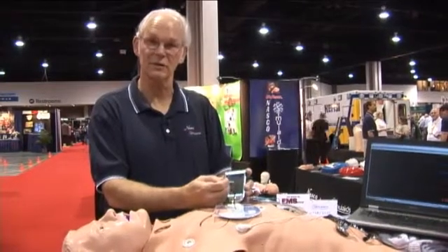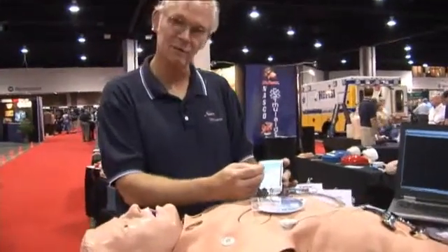It lists for under $20,000. It has a lot of unique features to it. It runs off from this pocket PC.